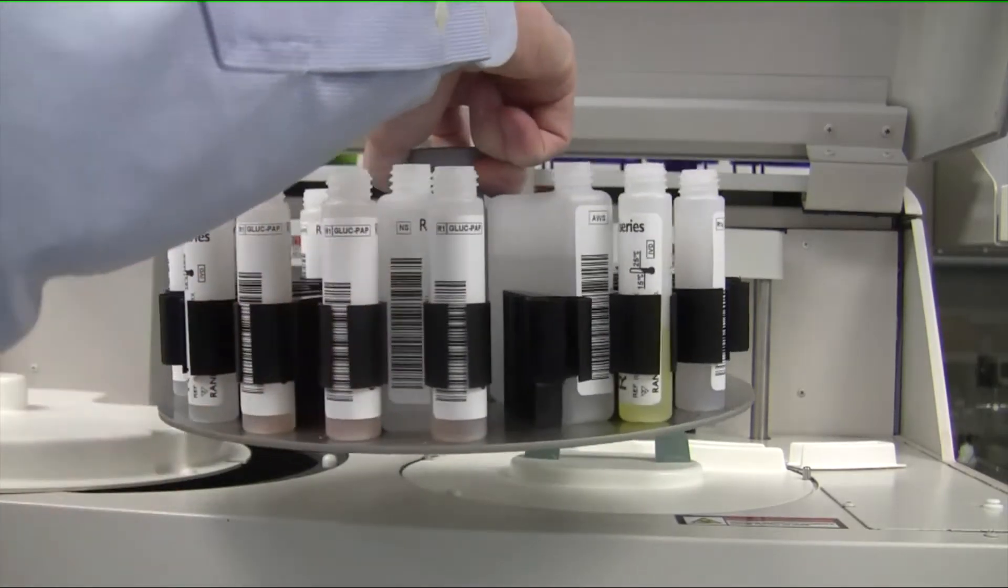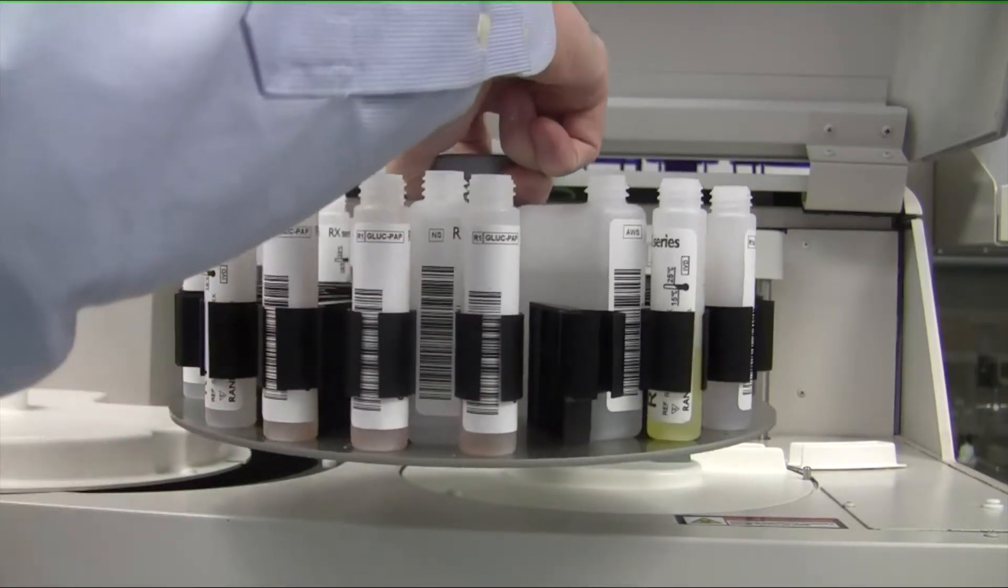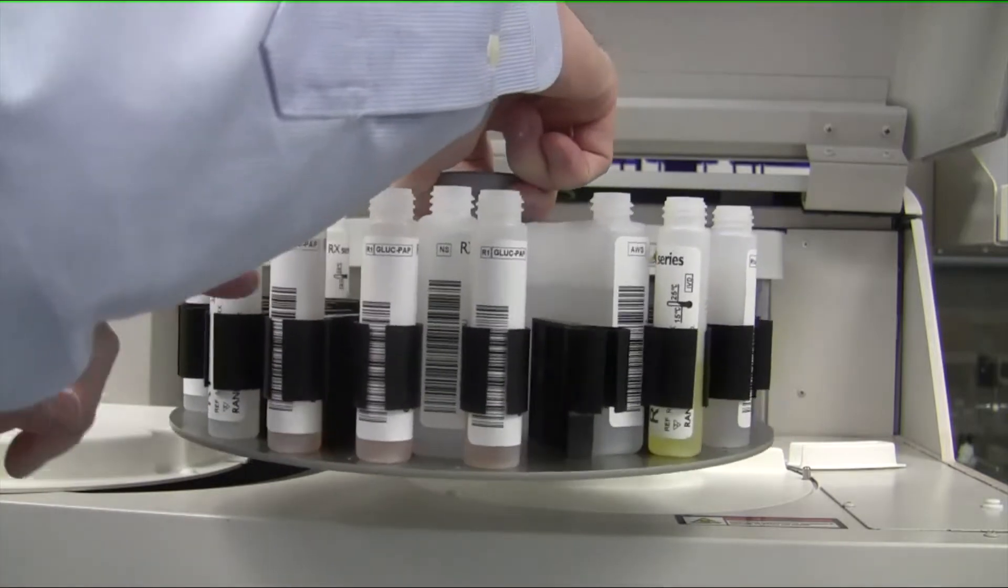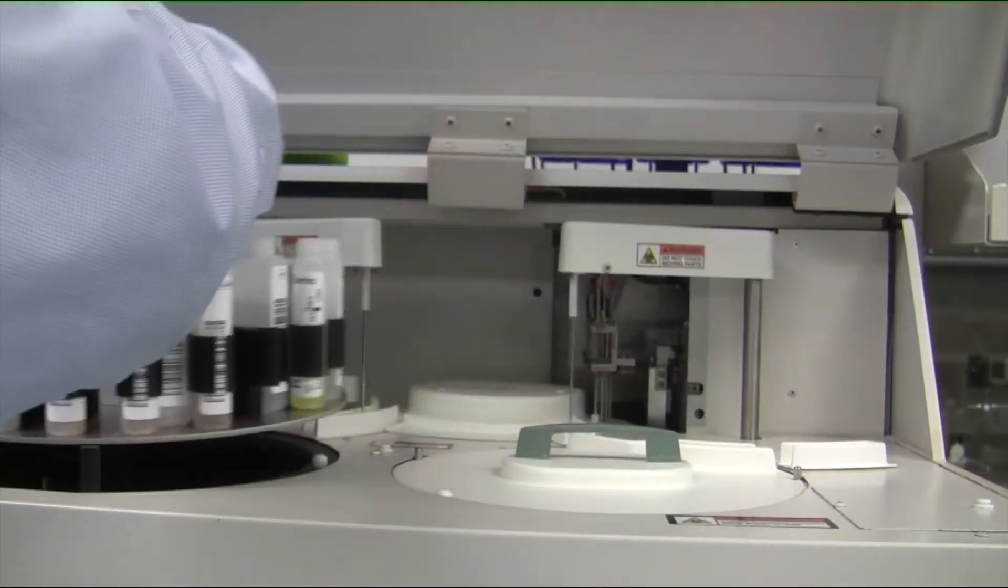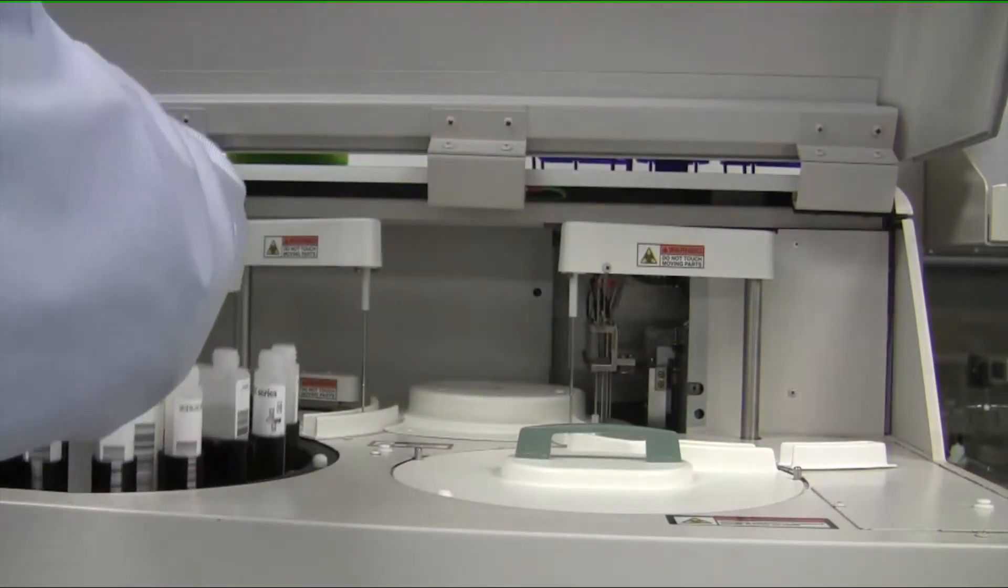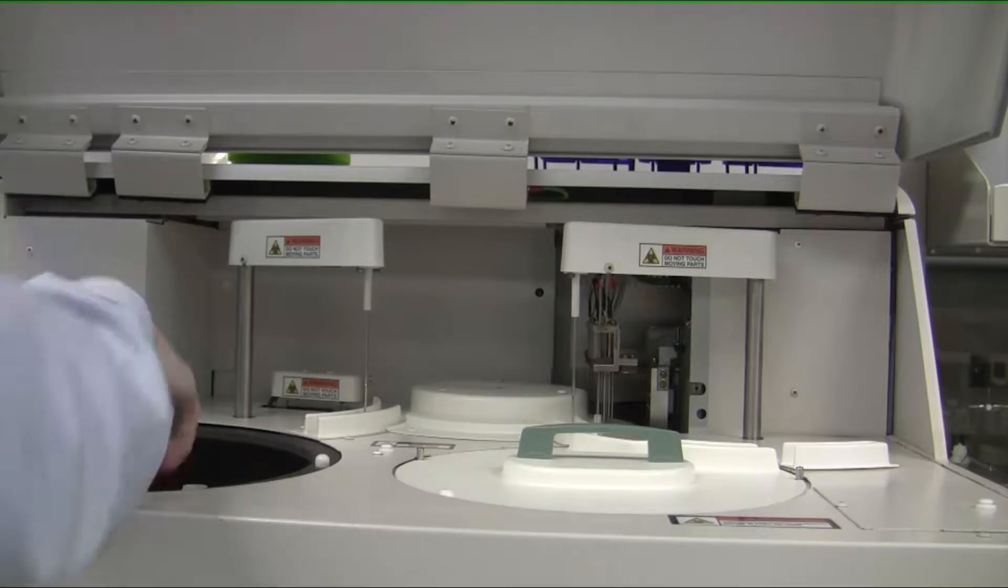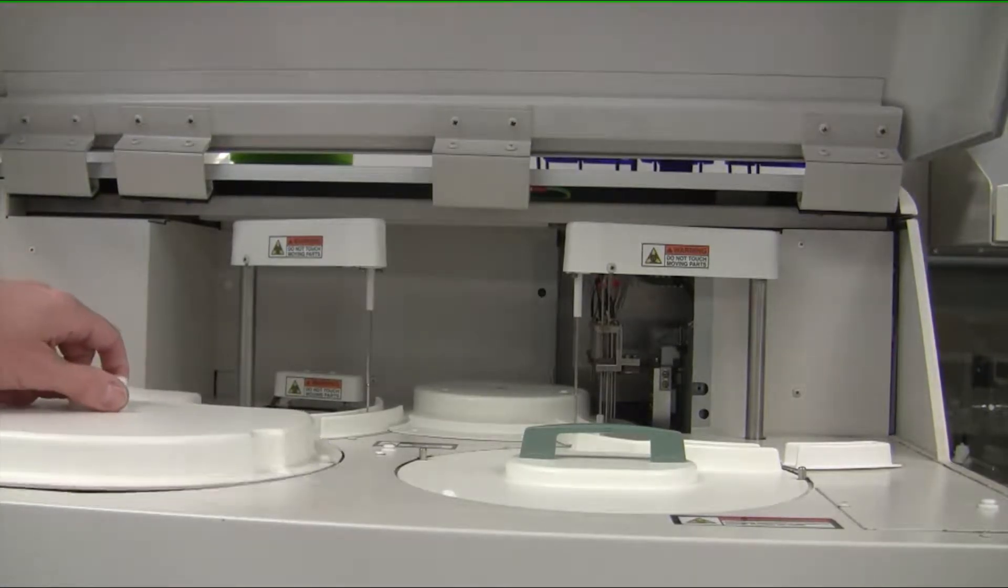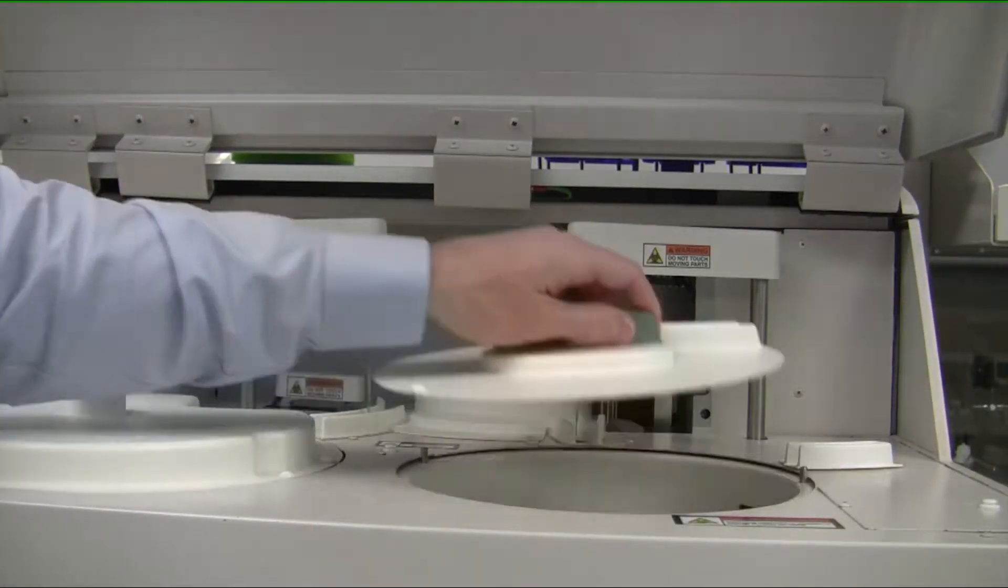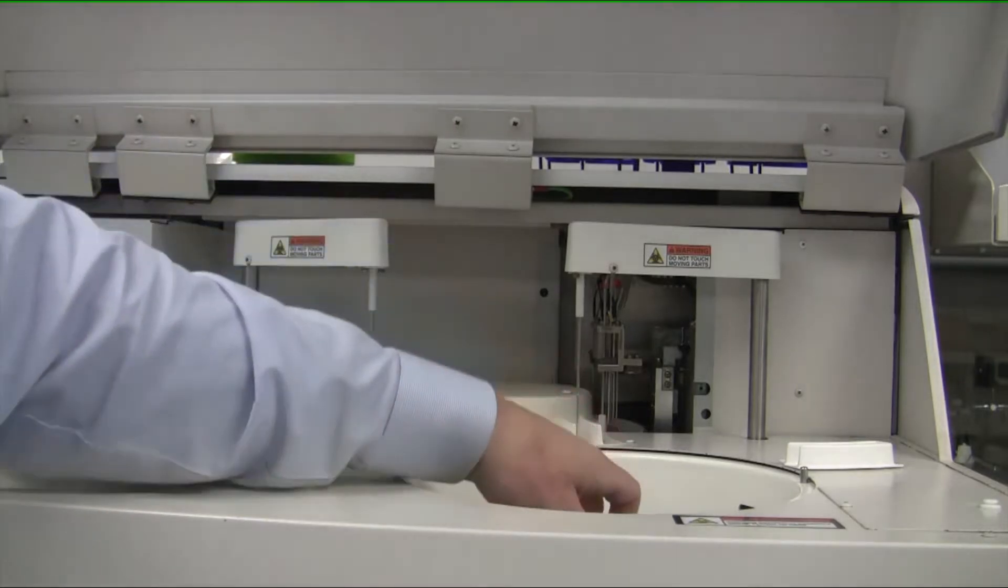To use, we just place the barcode out and we place it into the chamber. With a click of a button, the instrument will automatically recognize what reagents are on board.